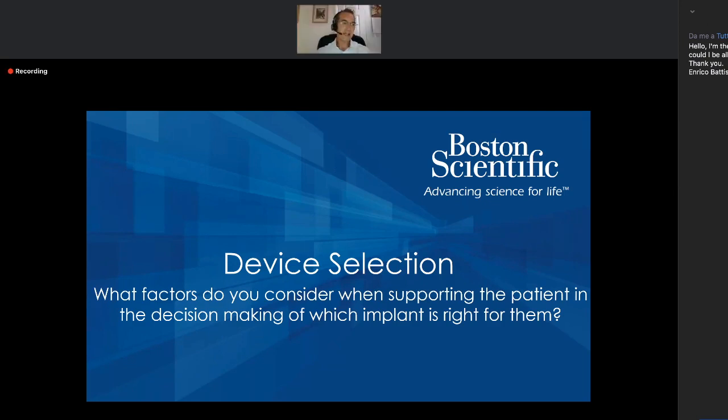Let's see what the audience consider important. So an interesting array of answers, as I think we can agree and see here. Certainly age and weight are considerations. Very importantly, and I think it applies to everything that all three of you have just been talking about, manual dexterity, and of course cost, as Gabriella was mentioning, around insurance. What I do find interesting, and I'd value your input, is that the partner's wishes, nobody was taking those into account particularly during this process. So do you find that interesting, unusual, or what are your comments on that, gentlemen?